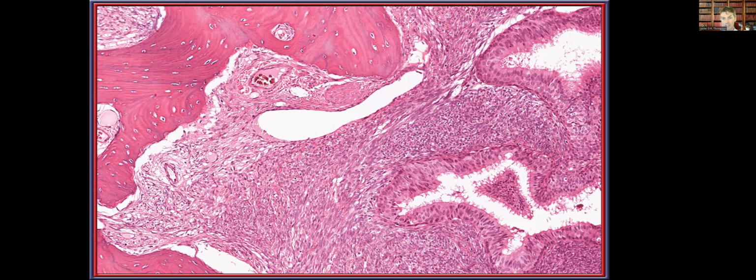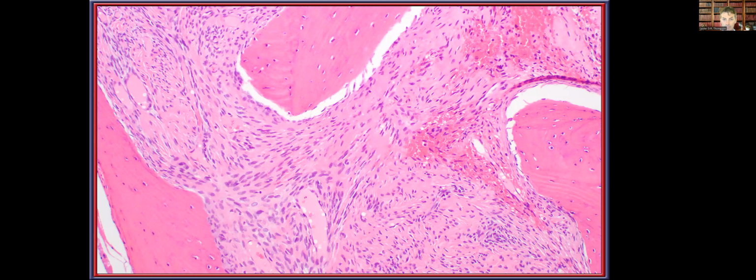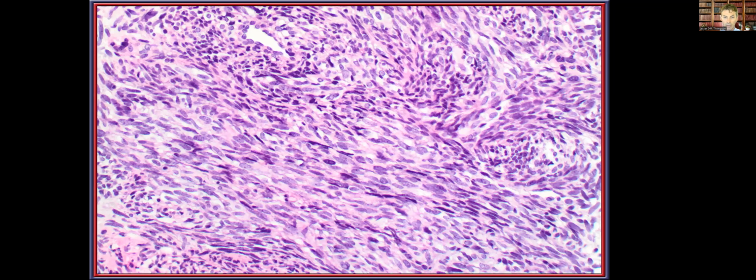But let me just tell you, if you get a limited biopsy of something like this, the notion of could this be an example of a synovial sarcoma or some other neoplasm with a biphasic presentation certainly does cross the mind as you're looking at these single high power field areas. Bone involvement is certainly present in many of the cases. I illustrated that in the slide that I drove at the beginning, but you can really tell how there is destructive involvement of the bone.